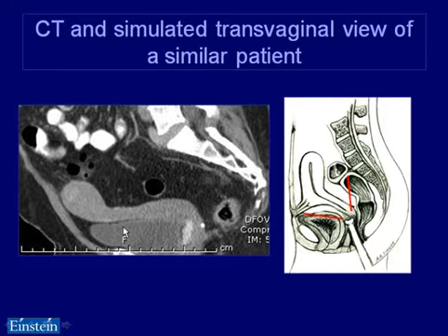So here's the urinary bladder. This is the fundus of the uterus, and the tethering and scarring is right about at this level. This is the main body of the uterus, and you can see that the cervix is pulled and elongated because the uterus is tethered here.